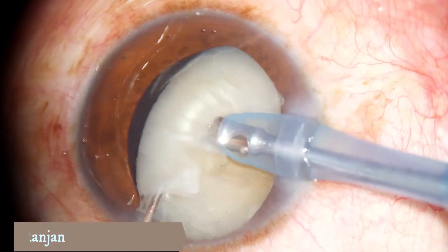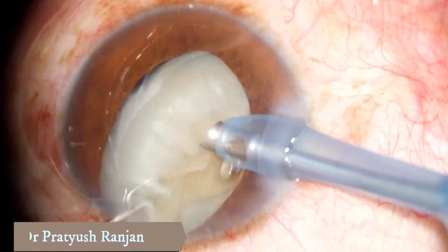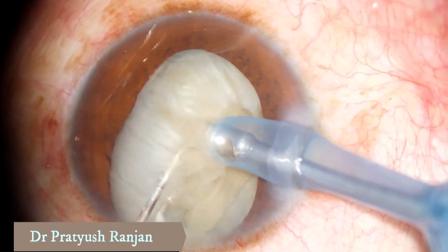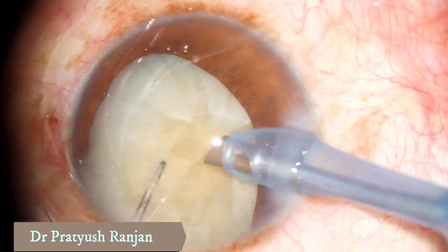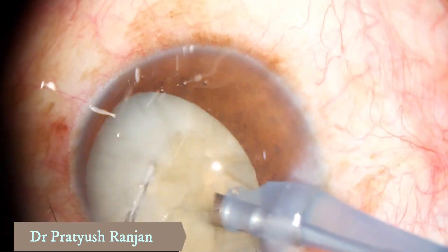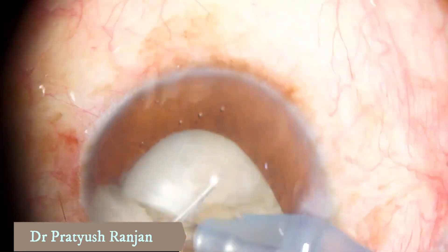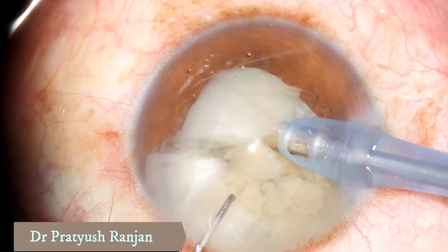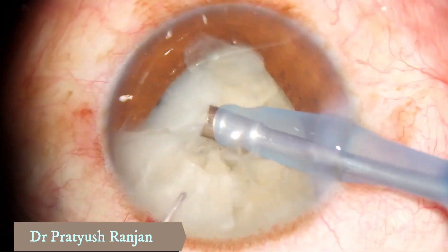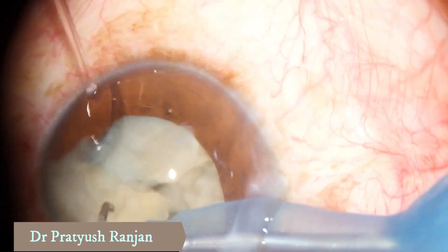This is how you do it in the real life scenario. Try to pull the nucleus up and from the equator, you try to give a horizontal chop under vision so that you are not disturbing the capsule. And you rotate and do multiple horizontal chops so that you sculpt the nucleus into various small manageable pieces.